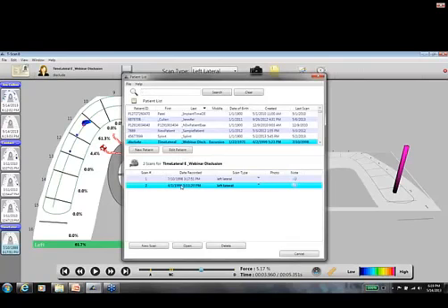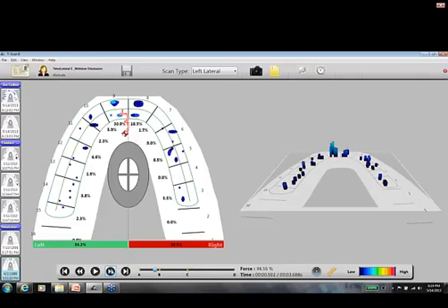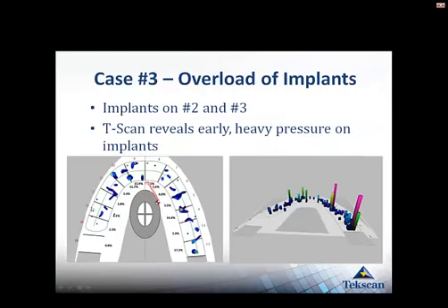So let's take a look at, obviously he made adjustments to that tooth. Let's see what it looks like now. The patient comes into their bite, and we're going to see them slide off to the left, come right up on the canine, and everything else goes away. So I think that's a good case to see how that might apply in your practice.